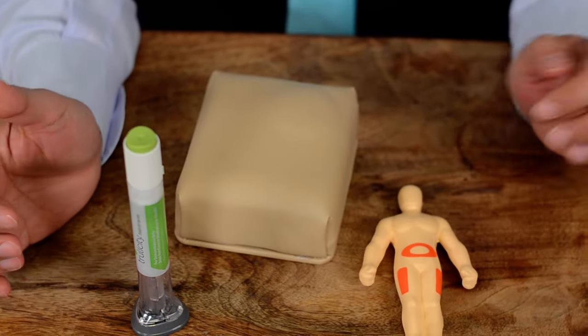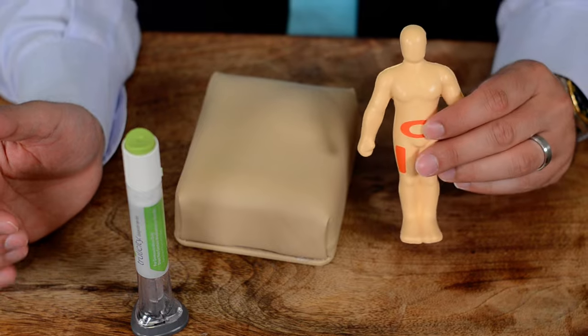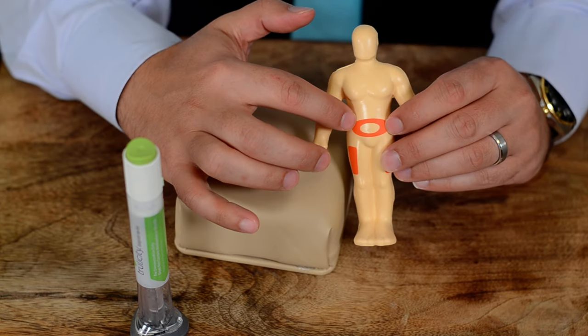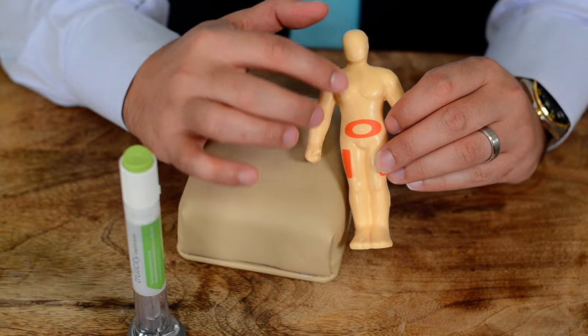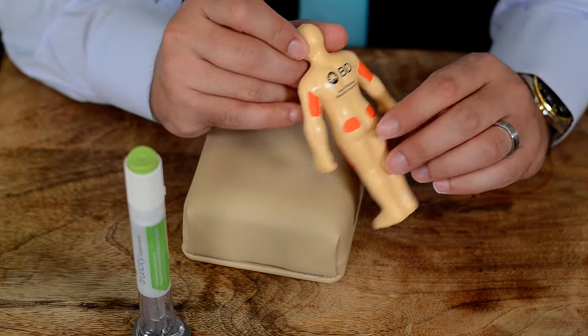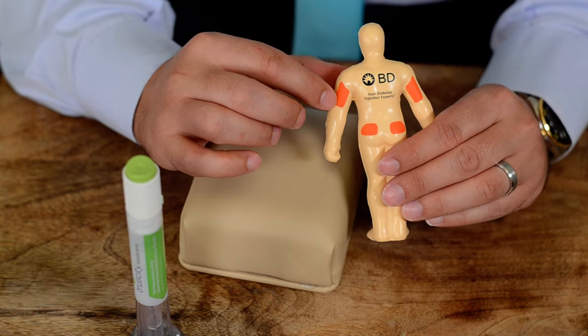Before we do that, let's show you where you can inject the Trulicity. Basically, you can inject at the upper thigh or in the abdomen. Make sure you do not inject close to the umbilical area, at least two inches away, upper buttocks, or the back of the arm.